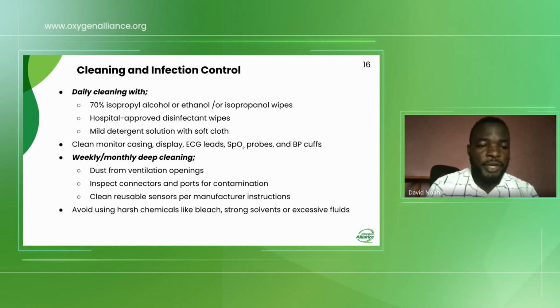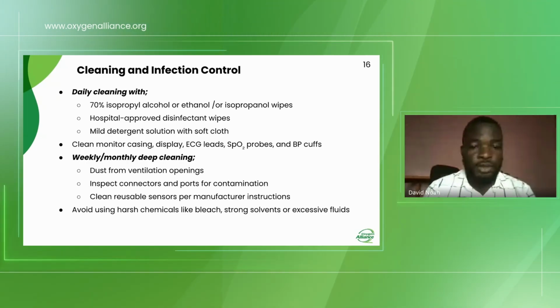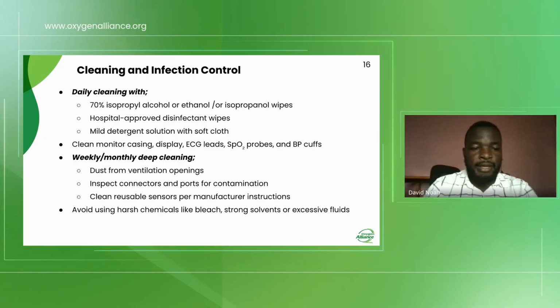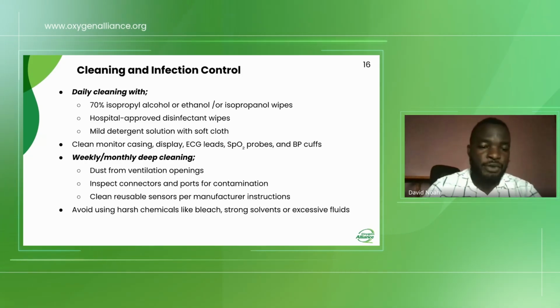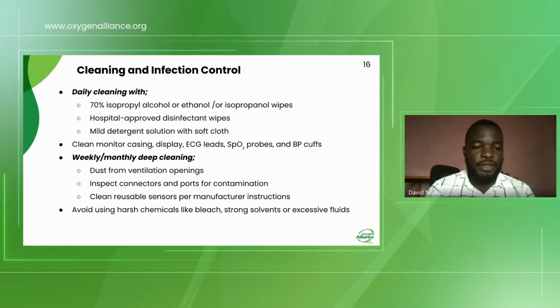Commonly we have 70% isopropyl alcohol or ethanol, or sometimes isopropanol wipes. Another important disinfectant is the hospital-approved disinfectant wipes, and also a mild detergent solution with a soft cloth.